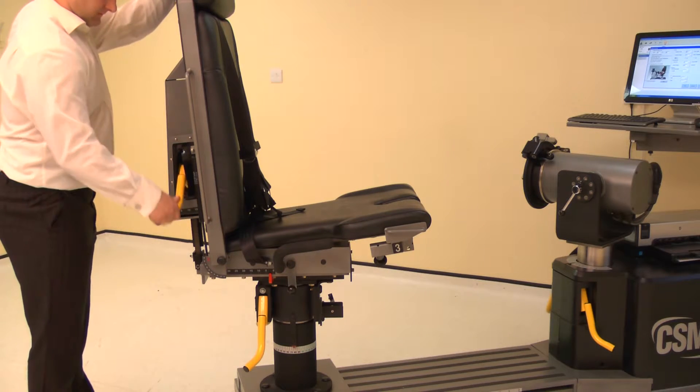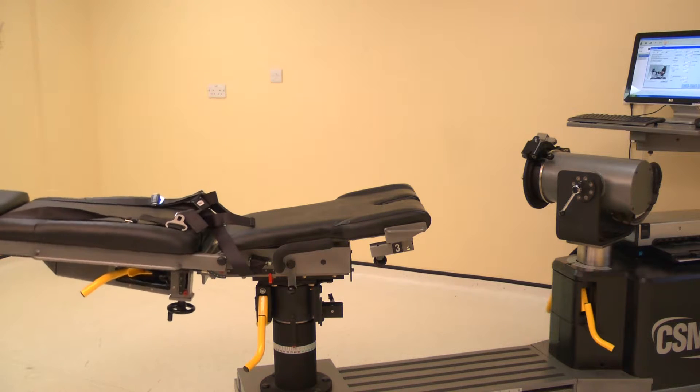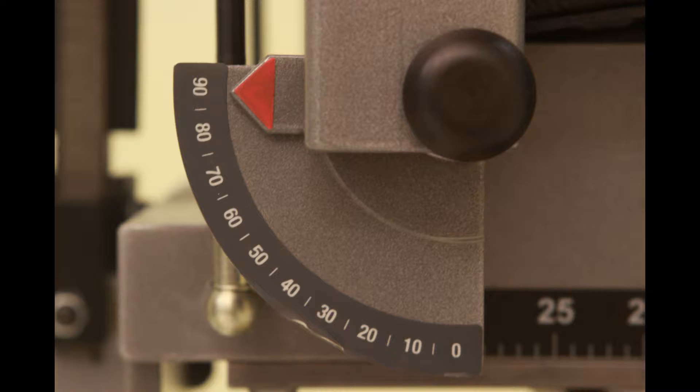To set the chair back angle, lift the locking handle and adjust the chair back. Adjust the back angle to 90 degrees. Ensure both locking handles are pushed down to secure.